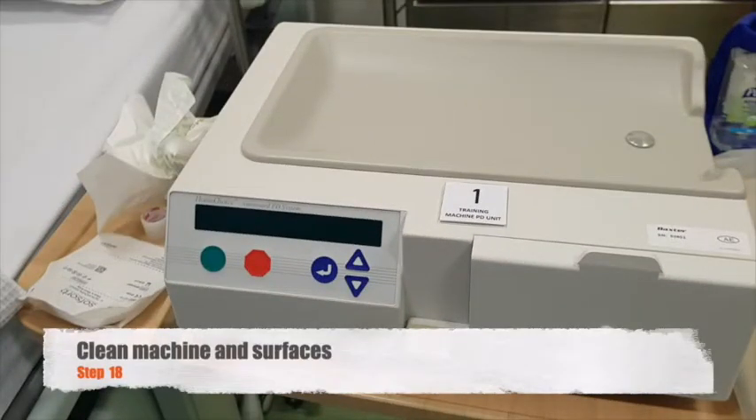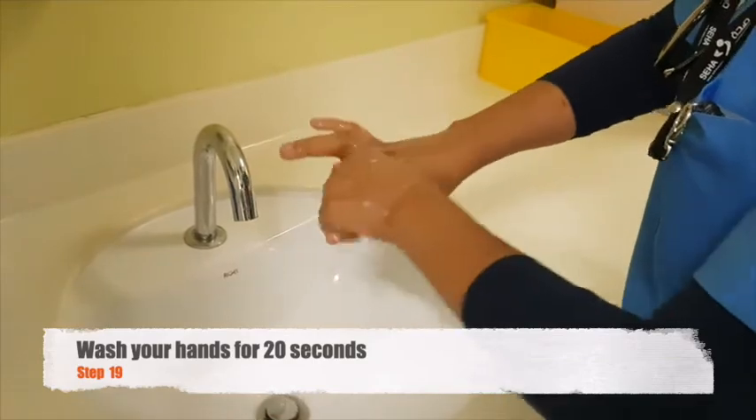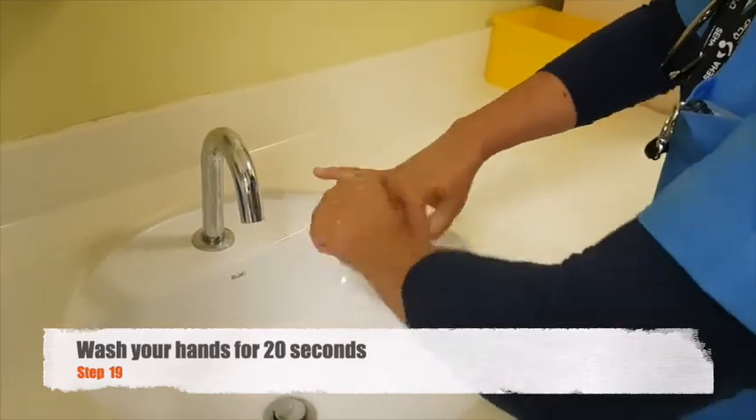You can now clean the machine and the other surfaces and do your aftercare. Don't forget to wash your hands for 20 seconds after the procedure.